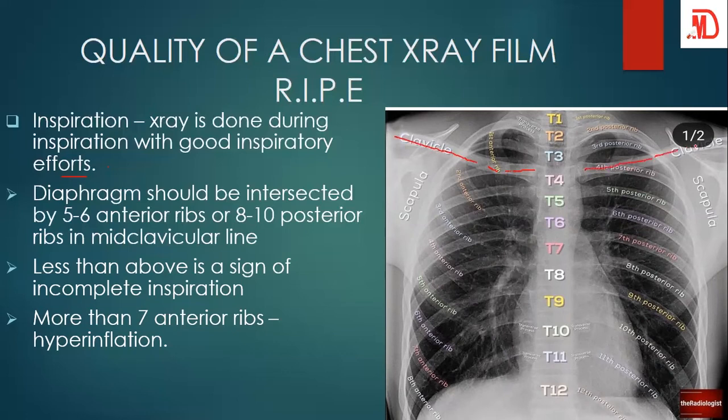You take it out. Fantastic. And luckily for us, the labels are here. So over here we have the anterior ribs. We have it here, there. The third, the fourth, the fifth. Okay, so now we see the mid-clavicular line.